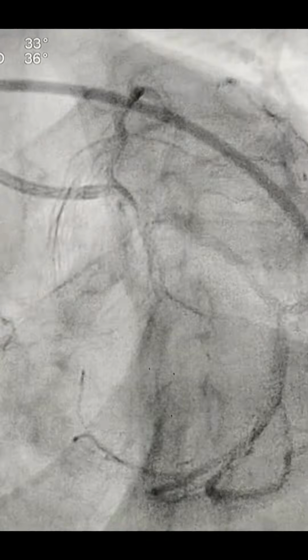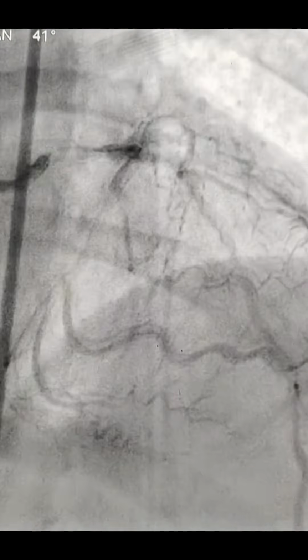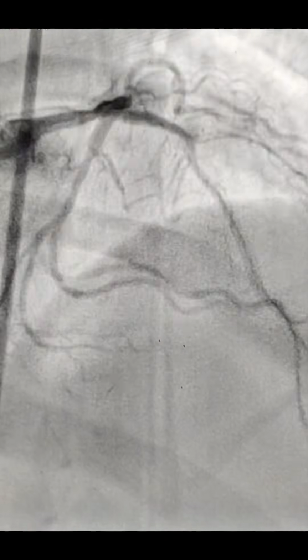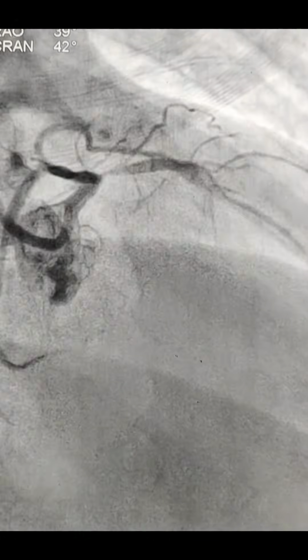So on the second day, we ordered the IVUS, and this is the cranial view, and you can see there is a mid LAD lesion also. We decided to do the angioplasty to the mid LAD and then the ostial LAD. This is the caudocranial view. You can see the same thing. There's a bend in the mid LAD where the lesion is exactly.